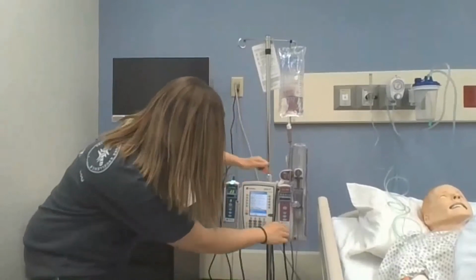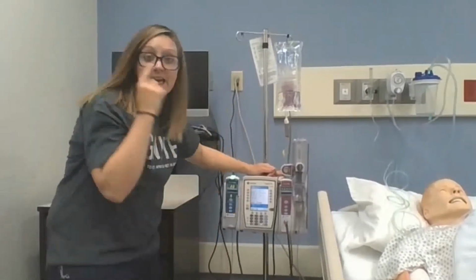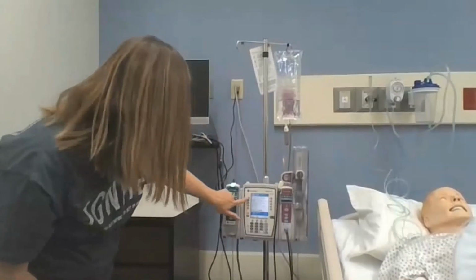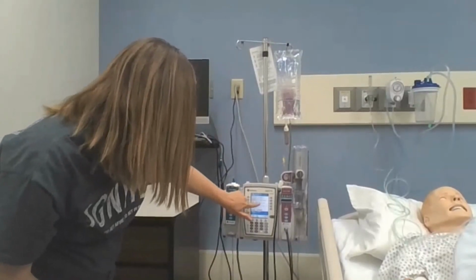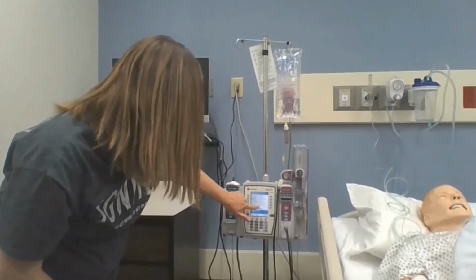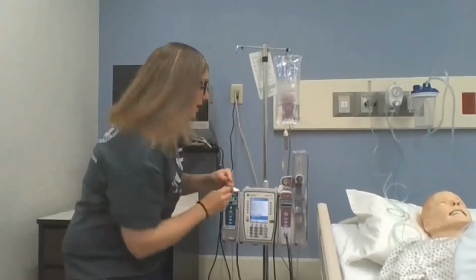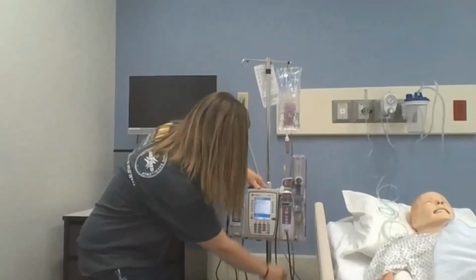So then it's going to just have me verify. And this, again, is where your second RN is going to come into the bedside, check your orders, and confirm that you are giving 0.2 milligrams every 10 minutes with a continuous dose of 0.2 milligrams every hour with a maximum limit of 1.4 milligrams in an hour. And they're going to confirm that with Beacon and make sure that we are correct. And if that's correct, we're going to hit start.